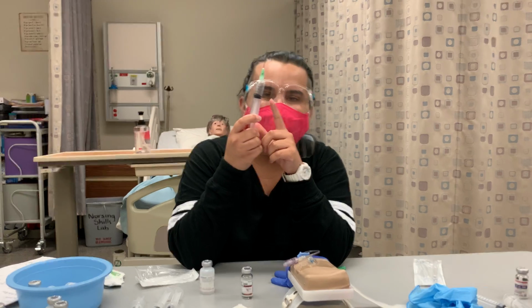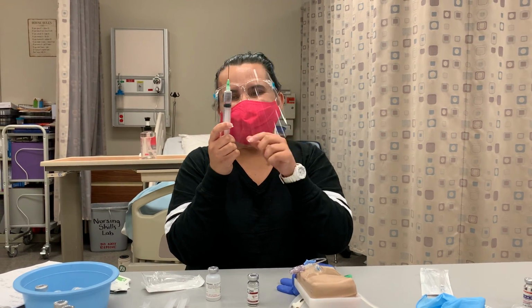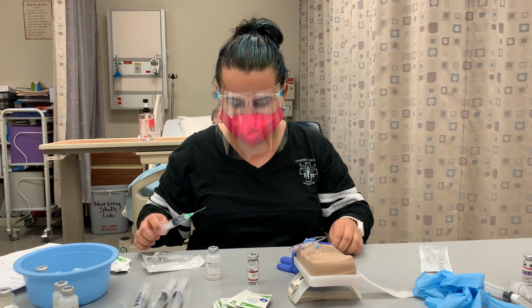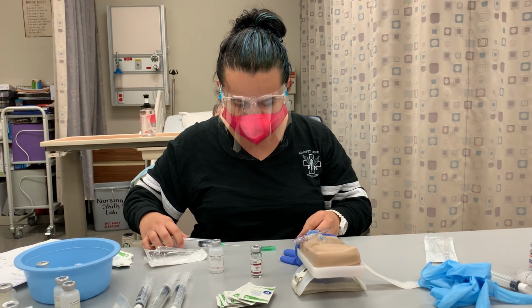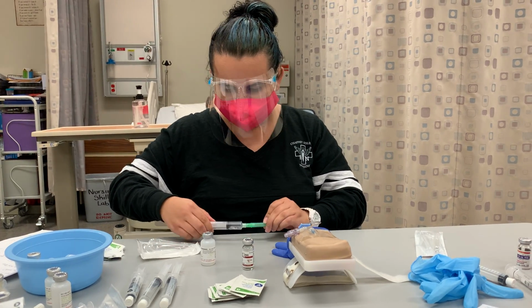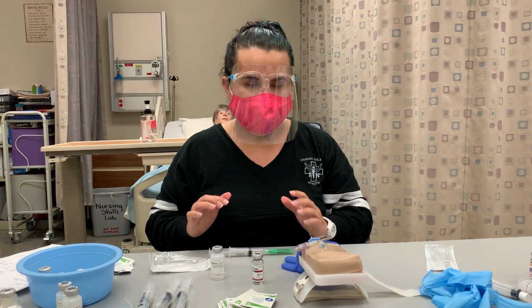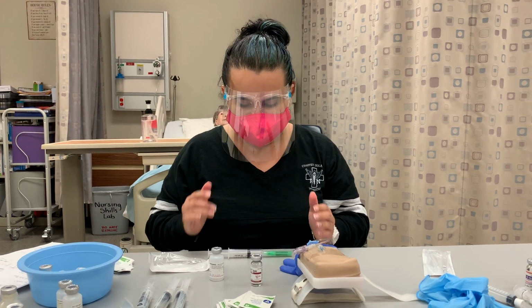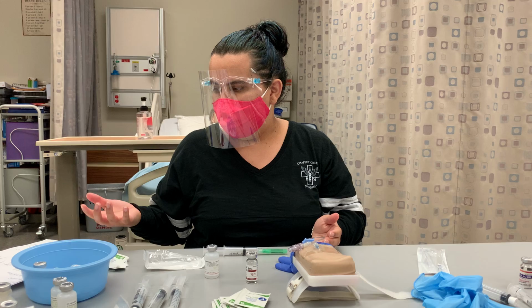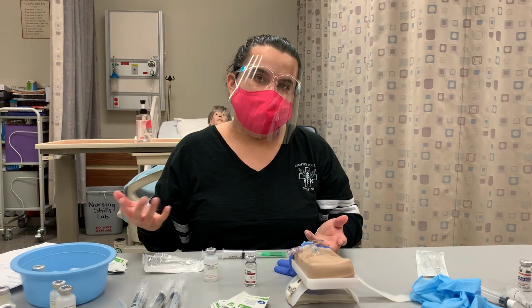But there's water all over it. So it would be 6 mLs. So now what I'm going to do is make sure, safety first, that my syringe is capped. From here, I will label my syringe. I will label what the medication is, how much of it is. So in this case it is 4 milligrams per 6 mLs.